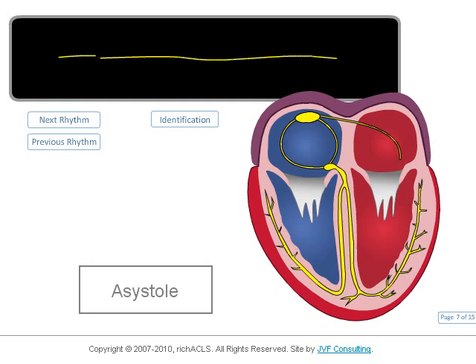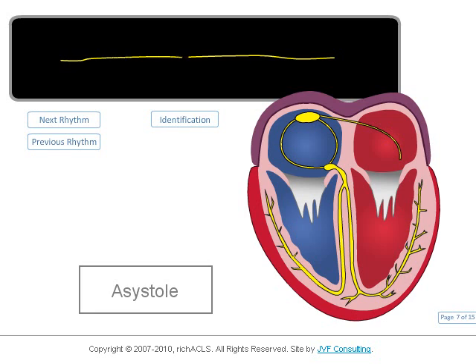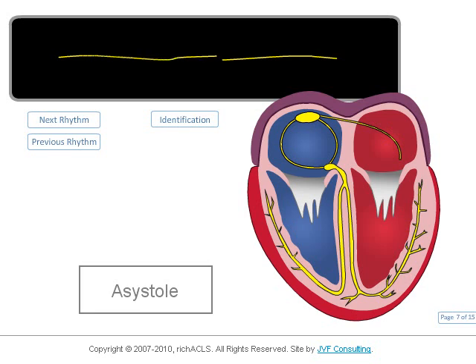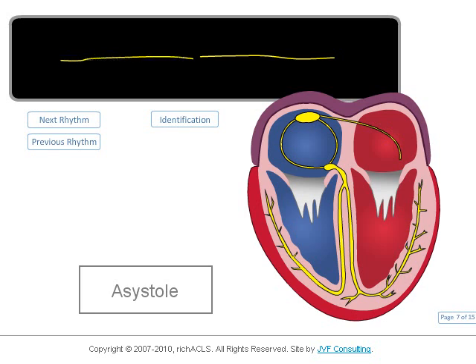Historically, this rhythm has been aggressively treated with drugs and an external pacemaker, but the data has shown such a dismal success rate that the AHA wording is now: "Asystole may represent an agonal end-stage situation." Of significant note is the fact that pacing has been deleted from the asystole algorithm.